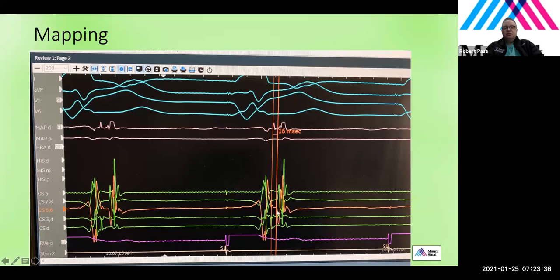So sometimes you make the decision that because of the benefits of catheter stability and hemodynamic stability, since sometimes you put someone in tachycardia and they don't really like it very much hemodynamically, and because of the ease of mapping, I accepted that this might be partially fused, because all the other benefits of stability, catheter not moving, a nice clean map, I thought outweighed the potential negatives.